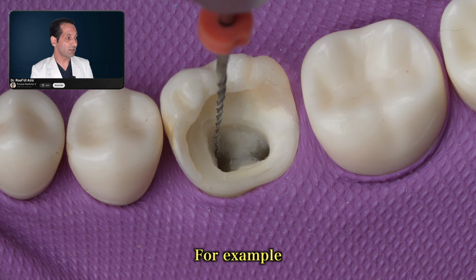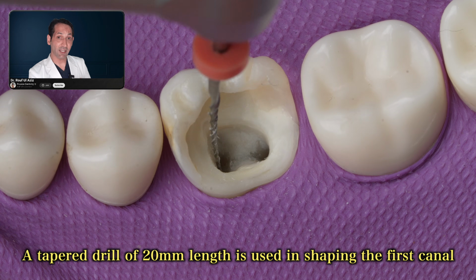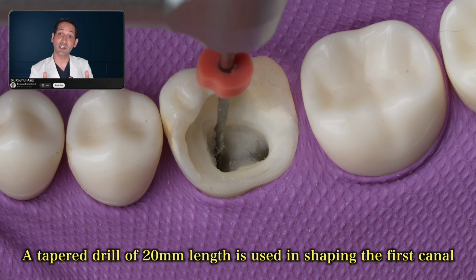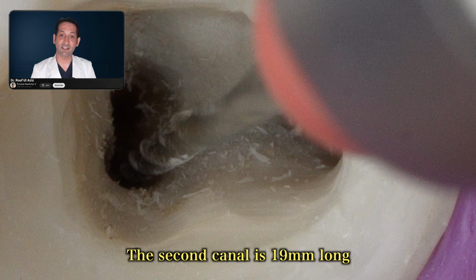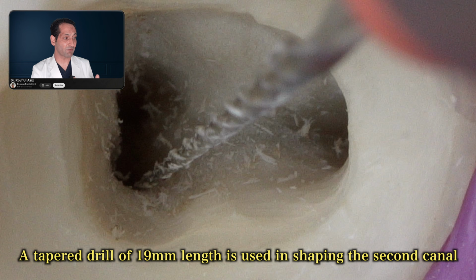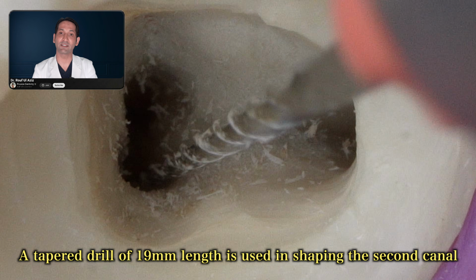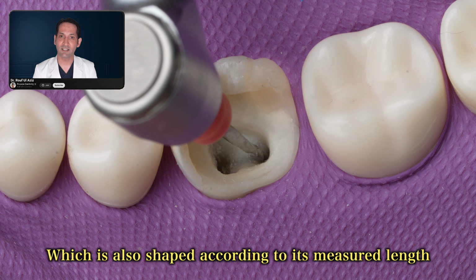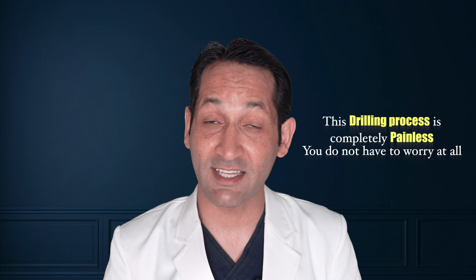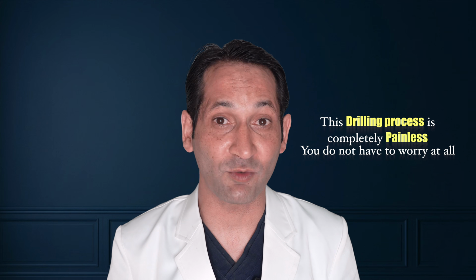For example, the first canal is 20 mm long, so a tapered drill of 20 mm length is used in shaping the first canal. Same for the second canal. The second canal is 19 mm long, so a tapered drill of 19 mm length is used in shaping the second canal. And the same applies for the third canal, which is also shaped according to its measured length. And trust me, this drilling process is completely painless. You do not have to worry at all.